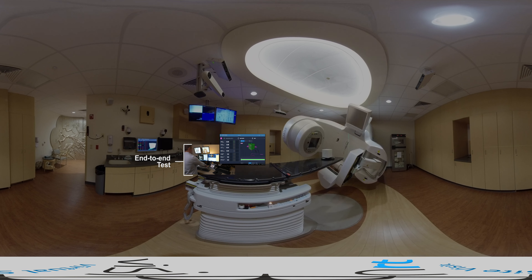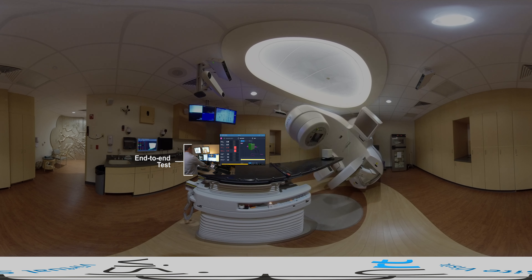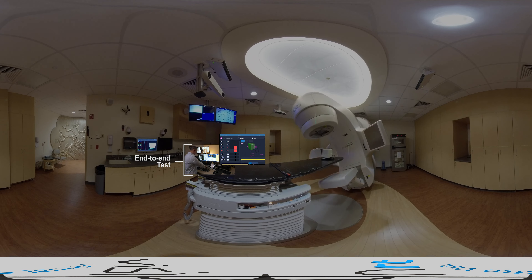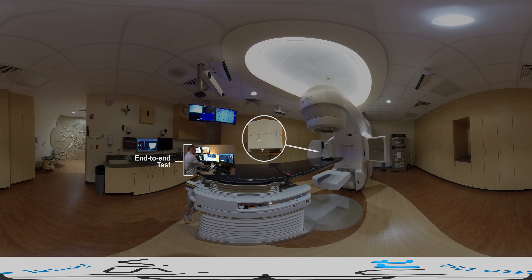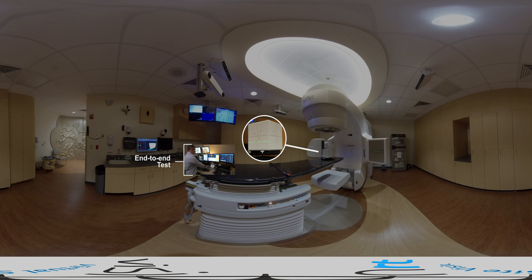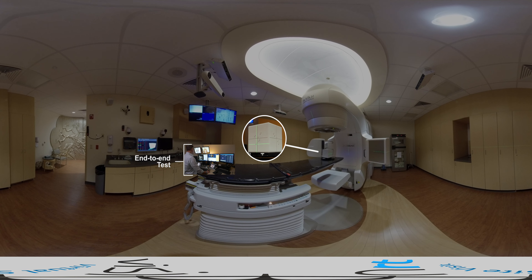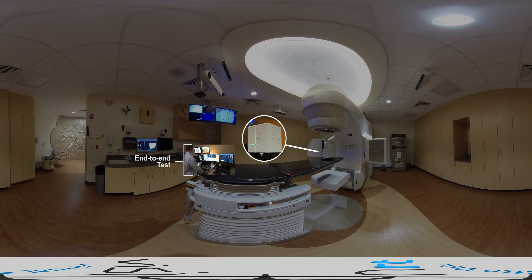The phantom is then positioned in the treatment room using AlignRT alone. Following initial setup, radiographic imaging is used to confirm the positioning. The phantom can be moved by known amounts to QA the relative displacement accuracy of AlignRT, and the plan can be delivered during AlignRT monitoring to measure the tracking stability.